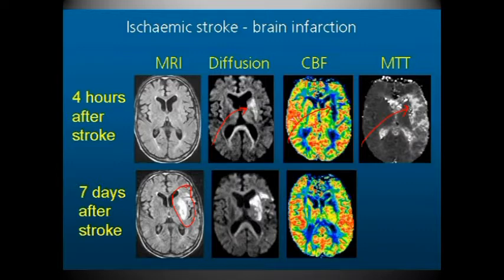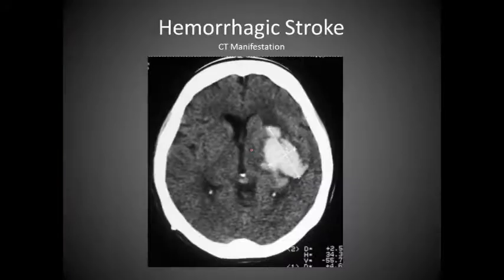So while the damage may not appear initially as great, it's amplified by the different techniques. So it's very, very essential that MRI be used for an ischemic stroke, just simply because it has such a high rate of being able to distinguish symptoms from actual onset versus CT. The parietal lobe.